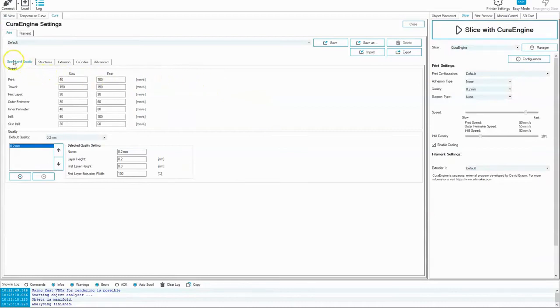You want to make sure that your speed and quality is set so your slow is at 40 and fast is 100. That opens up your range. The rest of the travel information, layer information, all of that can be left alone. Where it says name, as far as selecting quality and settings, this is set to 0.2 millimeters. Now, this is a default quality.